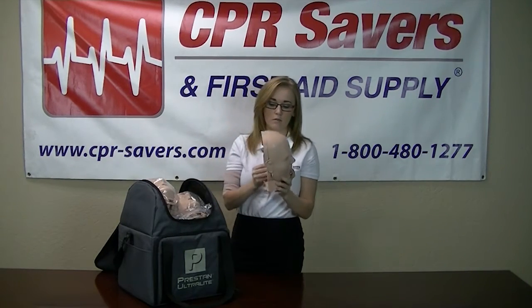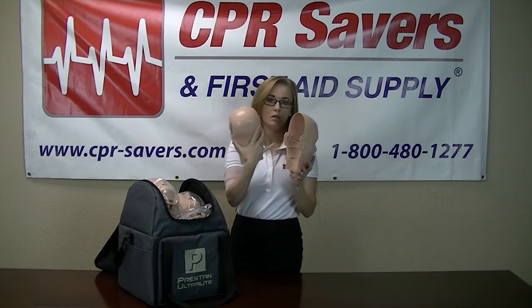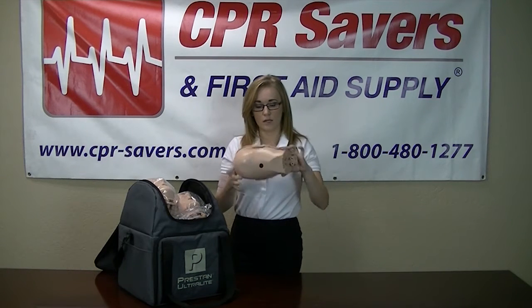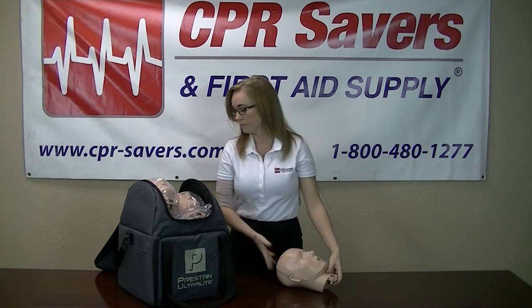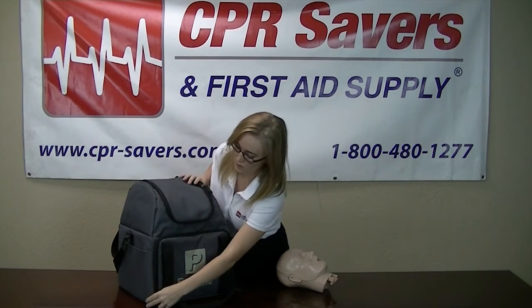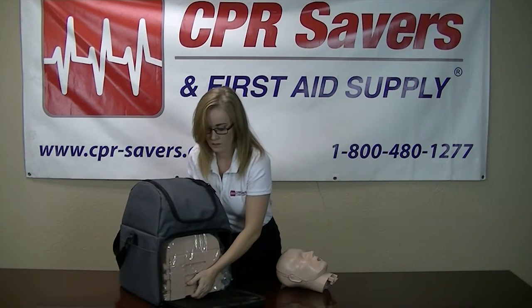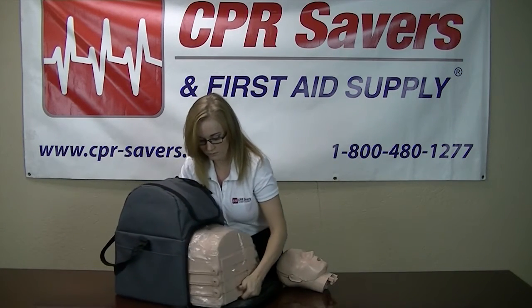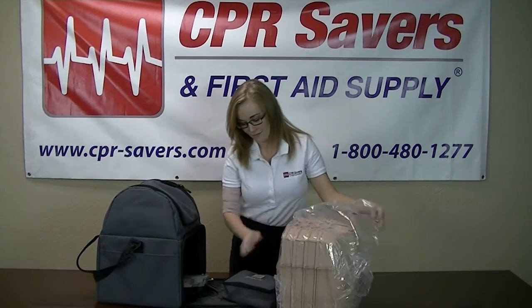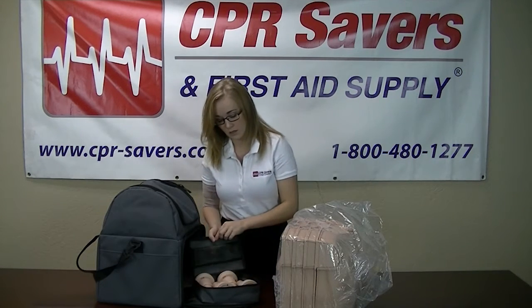These are two-part heads. To assemble them, what you're going to do is slide the two notches into the two grooves on the back of the head. Snap right in and line up at the bottom. In the bottom of each bag, you're going to have the four torsos, the lung bags, and your compression pistons. All four compression pistons are going to be in their own carry case.